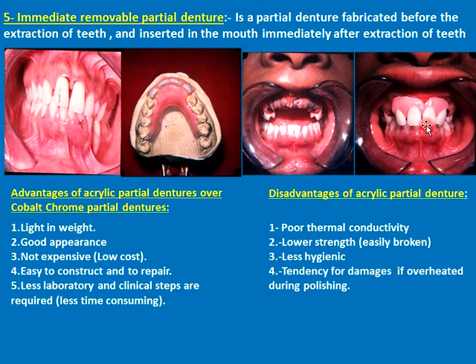And now here, this partial denture now, it is an immediate, but he's going to wear it for a period of time, so it might be transitional partial denture until we reach a more definitive treatment. Or when we are going to use tissue conditioning material, then it is called a treatment partial denture. That's what I said in the beginning of the lecture. And هاي partial denture يعني they resemble each other in use. An immediate denture might be regarded as a treatment partial denture, and might be regarded as a transitional partial denture.